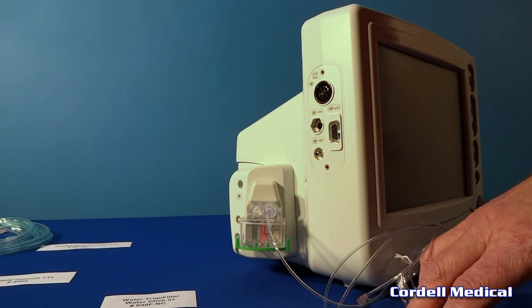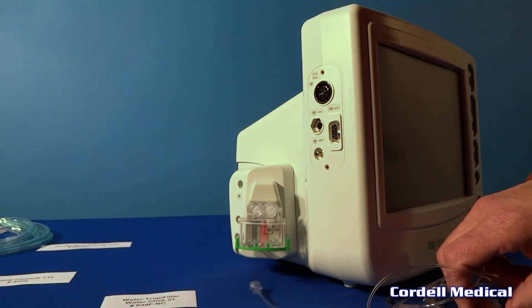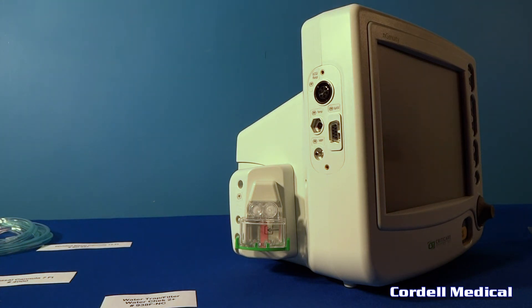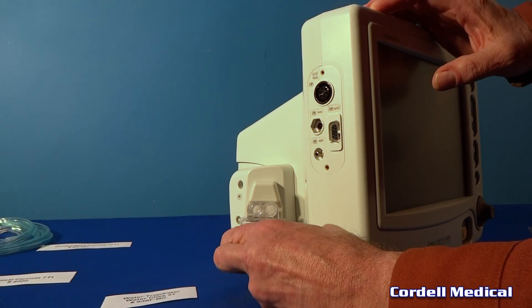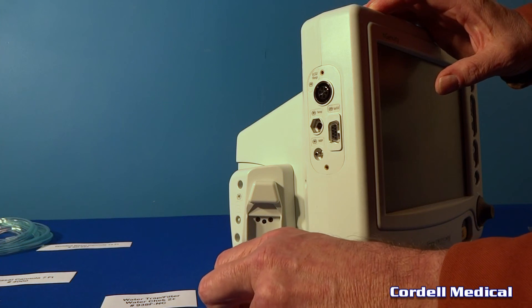We'll take that out and set it off to the side. To remove the water trap, just press in on the locks and let it drop straight down. That's off the monitor at this point.